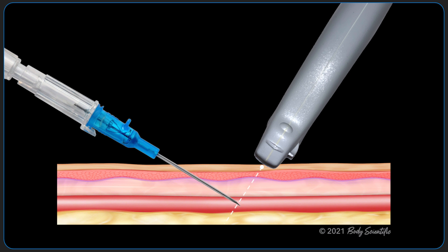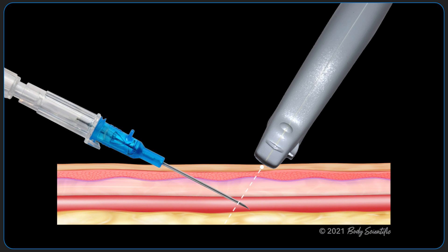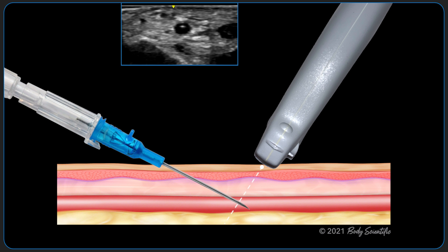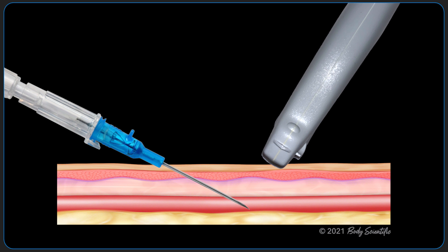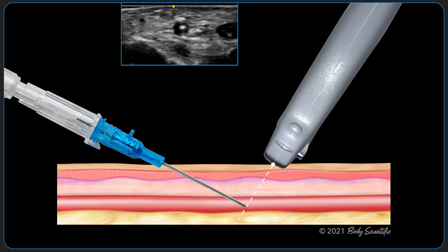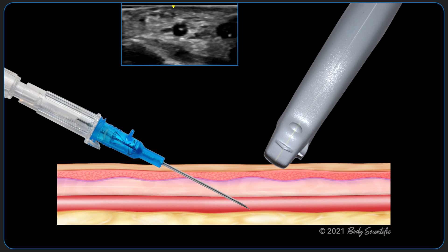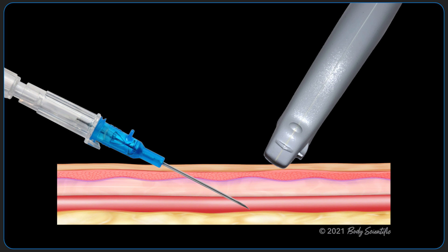The smallest observable part is the tip of the bevel. When the bevel tip is visualized and properly positioned, the angiocath may be advanced into the vessel until the ultrasound beam cuts again through the body of the bevel. This appears on ultrasound as an enlarging hyperechoic object in the lumen. The transducer is then translated proximally again to visualize only the tip of the bevel.